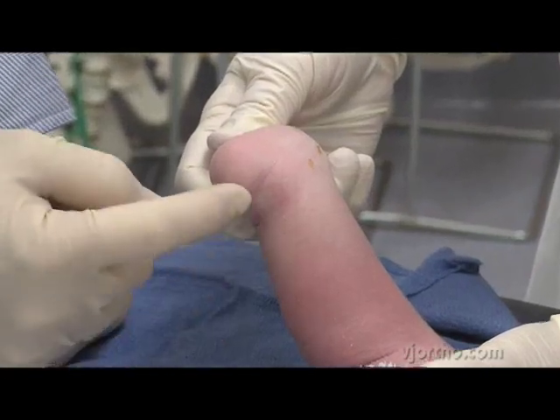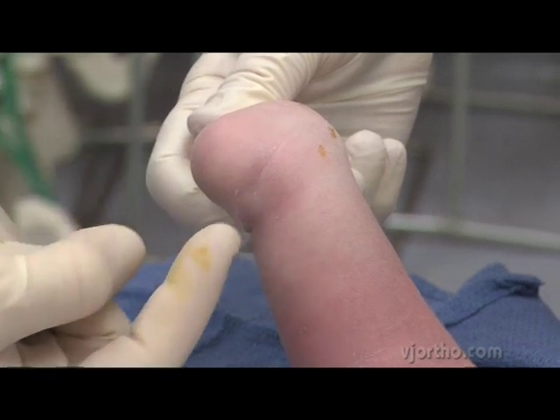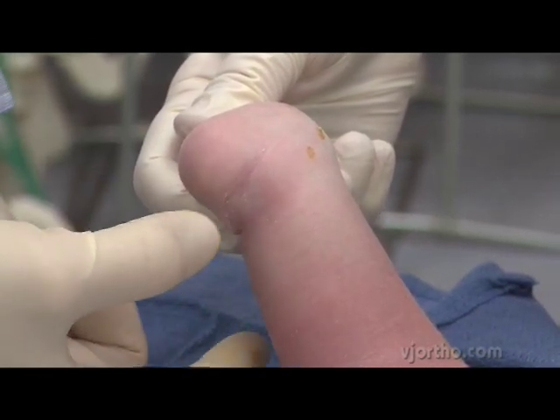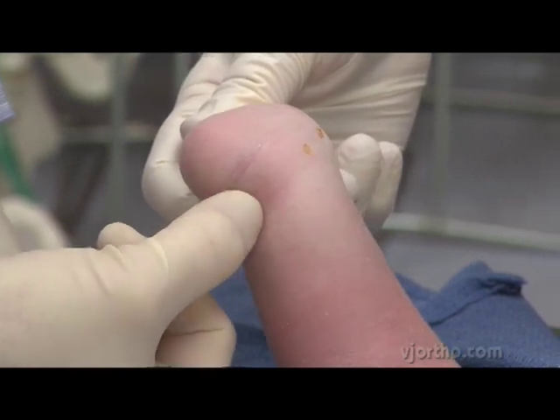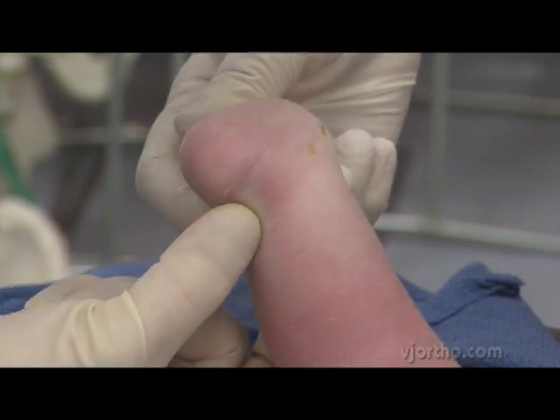This is the typical error that people try to do — performing the tenotomy right where they see the crease. That's actually too distal; it's right on the calcaneus rather than on the heel cord. So it's important to see the crease and then go a centimeter proximal to that — that's where the tenotomy is going to be done.